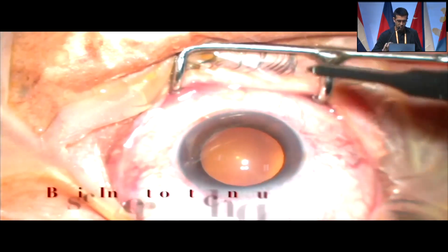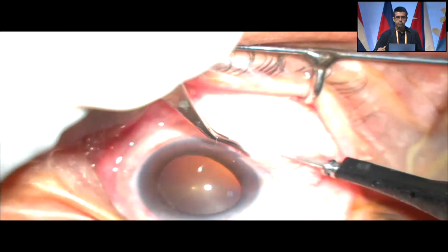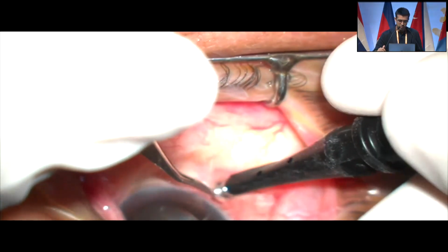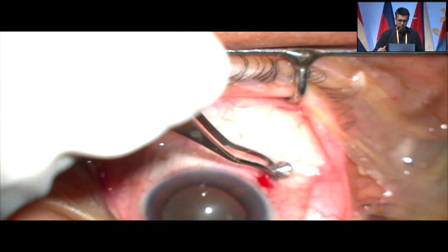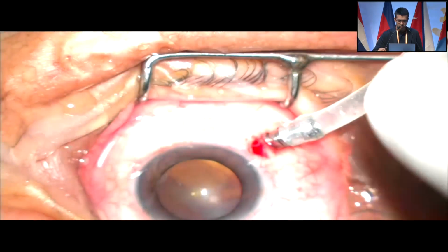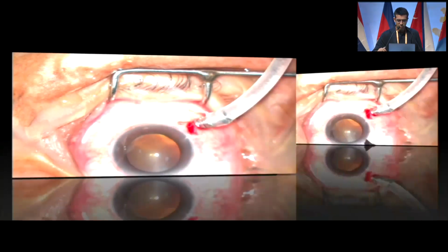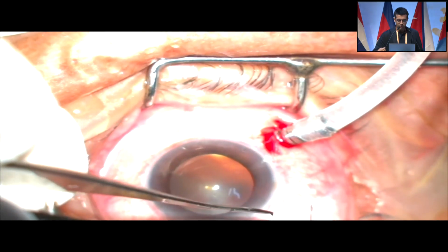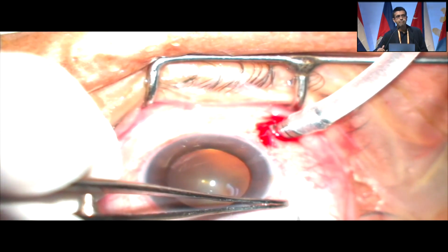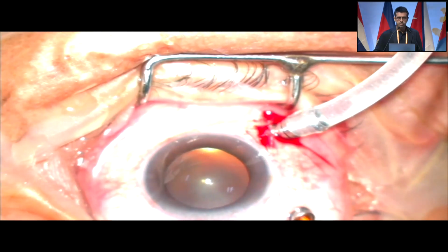For phaco, the cannulas are inserted 4 mm from the limbus. The conjunctiva is retracted slightly, and the trocar cannula is inserted in a two-step fashion, initially going parallel to the limbus for half its length and then going perpendicular to enter the sclera. The infusion is secured in the infratemporal cannula. And the superior ports used for the vitrectomy cutter are plugged till further use. It is a relatively simple technique which can be mastered easily with little practice.